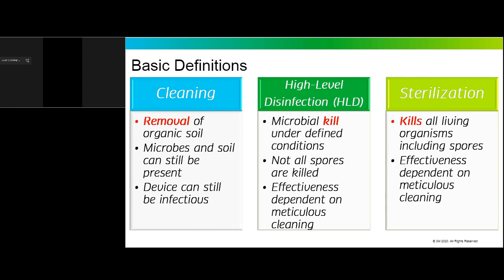In your clinic, you may use manual cleaning. You might have an ultrasonic cleaner, especially folks in the dental clinics tend to have ultrasonic cleaners. Or if you're at a larger ASC or in a hospital, you probably have automated washers. After cleaning, you can expect a low level of microorganisms to still be present on the instruments, so you still need to consider them infectious.